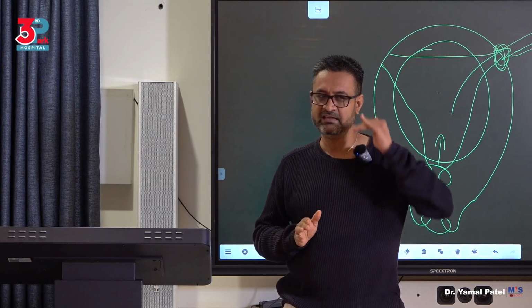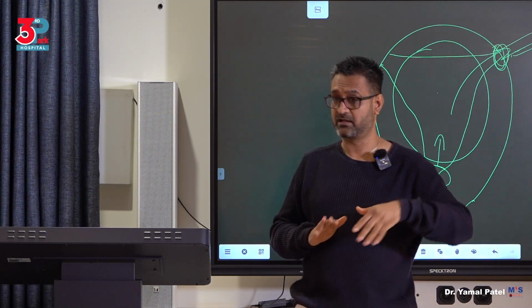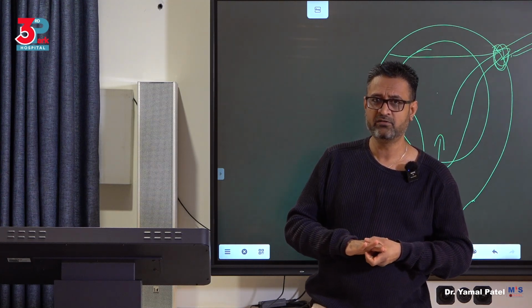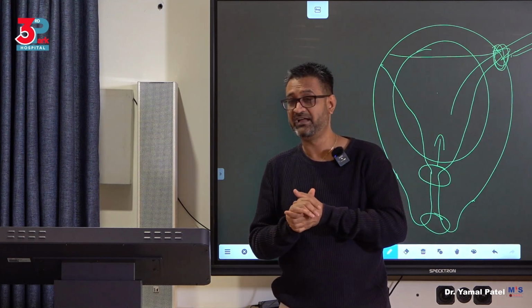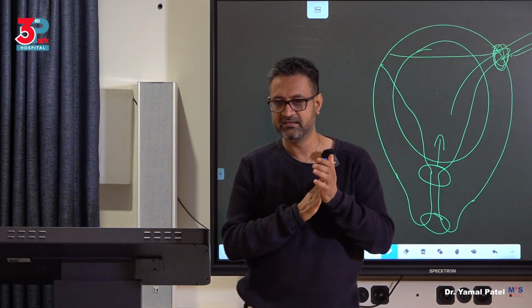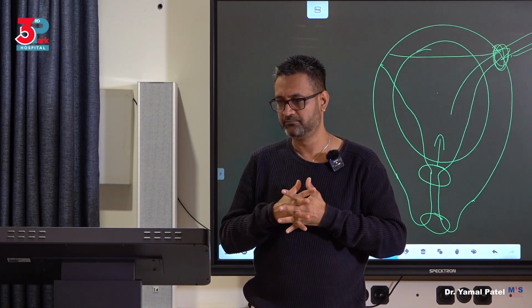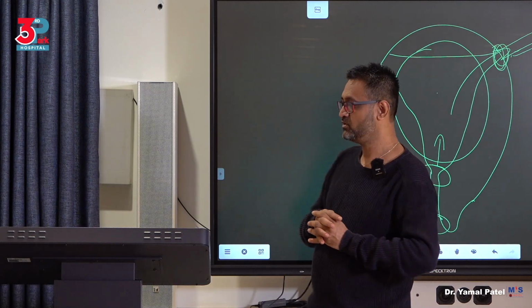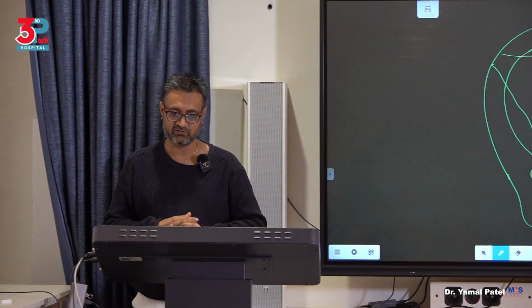So the deficit is inflow minus outflow that you can account for. So if you can account for inflow versus outflow of less than 2.5 liters, the patient is safe. So the cutoff value for saline is 2.5 liters deficit volume. Got it? Then you go into the ones for hypotonic solution. So we'll discuss that in fluids.